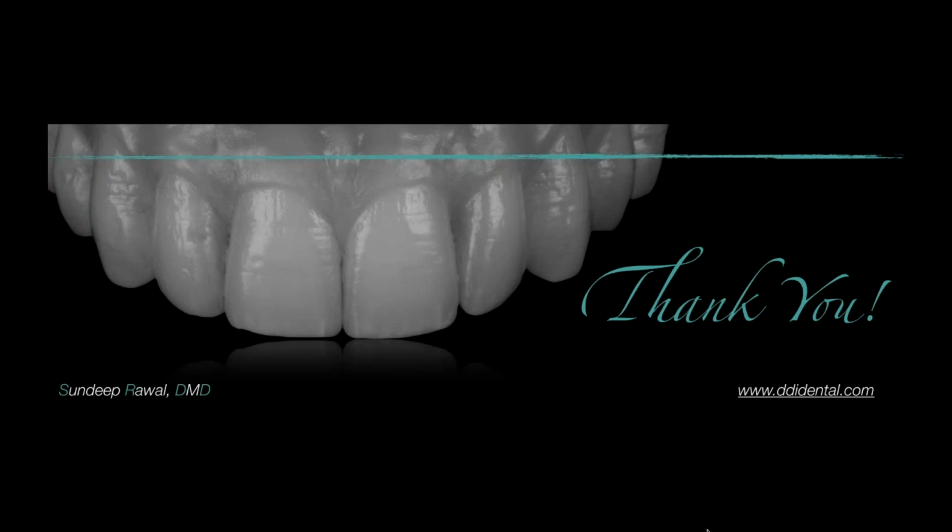In those systems, and the classic example of that is CEREC or Sirona, they work very, very well within their own architecture. The software is aligned, the parameters are all set up. It is a seamless integration. It is like me taking my Apple iPhone, watching a movie on it, plugging it into my MacBook Pro, driving home, going into my house and turning it on my Apple TV.